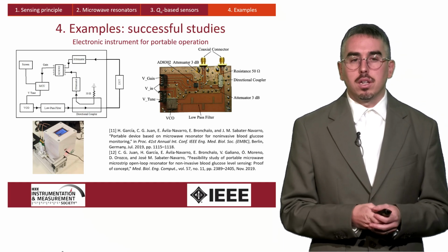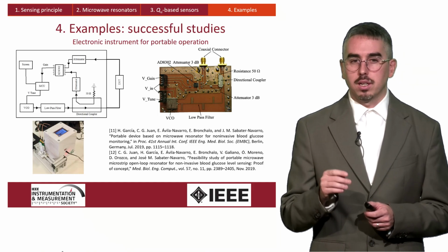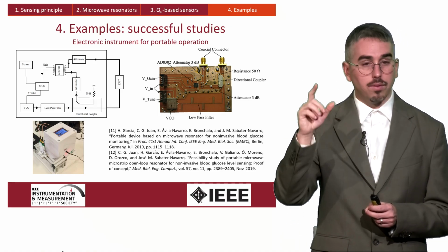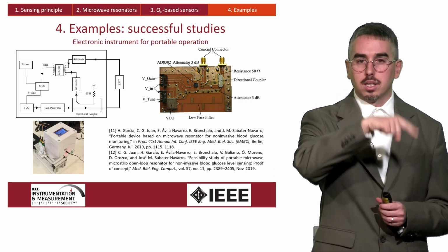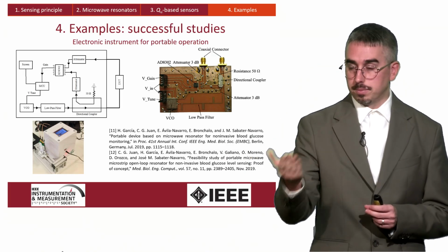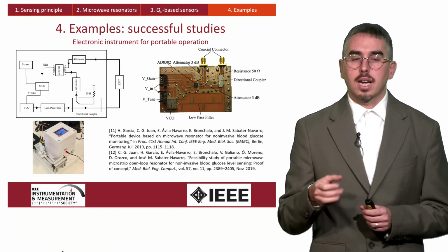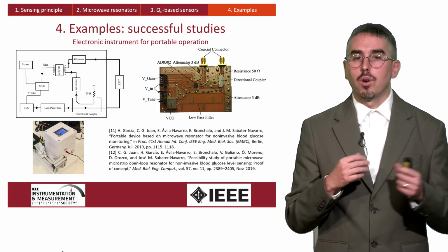For example, here everything started from the microcontroller unit, which fed a voltage control oscillator with a ramp voltage signal with increasing voltage values. At the output of the voltage control oscillator, what we have is a sinusoid signal with increasing frequency, which is what we are interested in. Of course, the signal must be filtered to avoid harmonics, and then thanks to a directional coupler, we can have a copy of the original signal and we can store the copy for comparison.